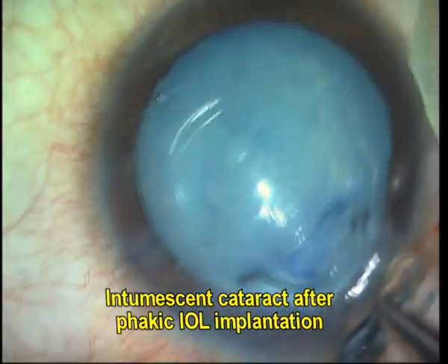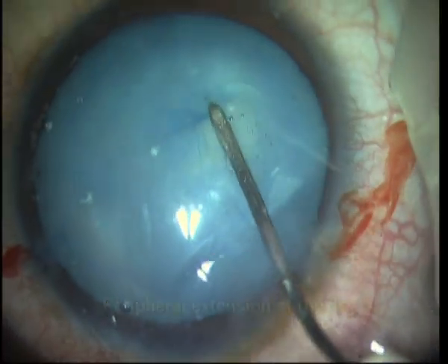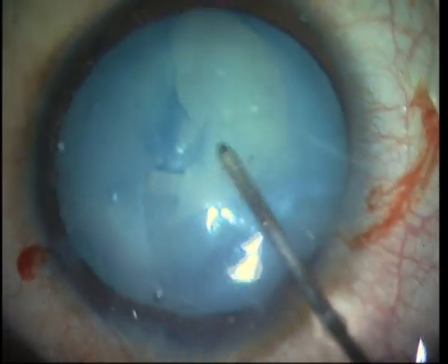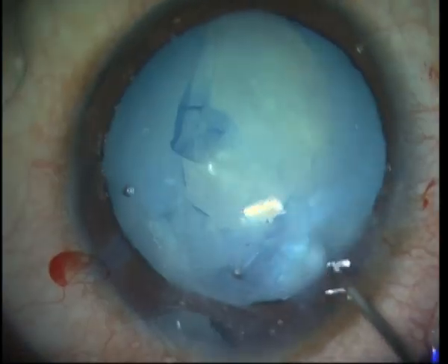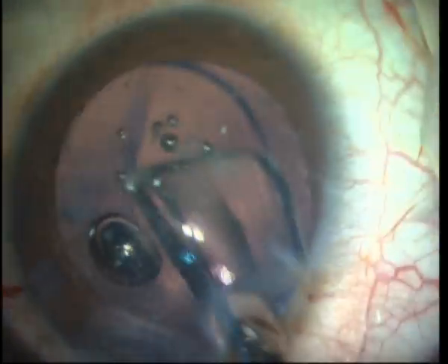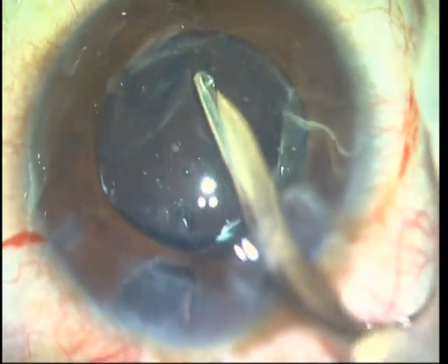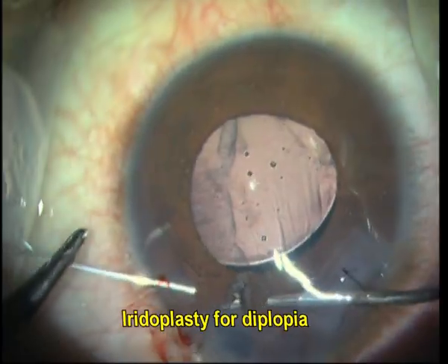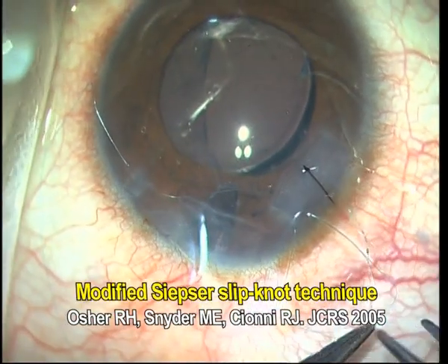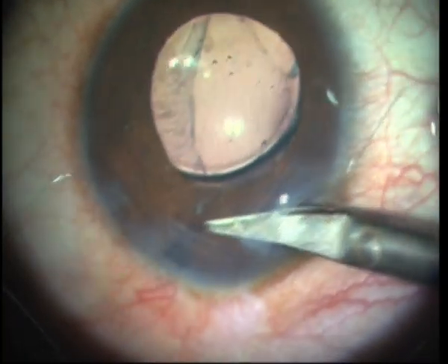Explantation of the ICL may become necessary in the setting of a cataract. A white intumescent cataract may be associated with problems in completing the rhexis successfully. However, the patients, generally being young, do not have a significantly dense nucleus. IOL power calculation should be performed carefully. Large iridectomies should be avoided as they can cause diplopia, especially if not covered by the lid. These may be sutured and made smaller if required.